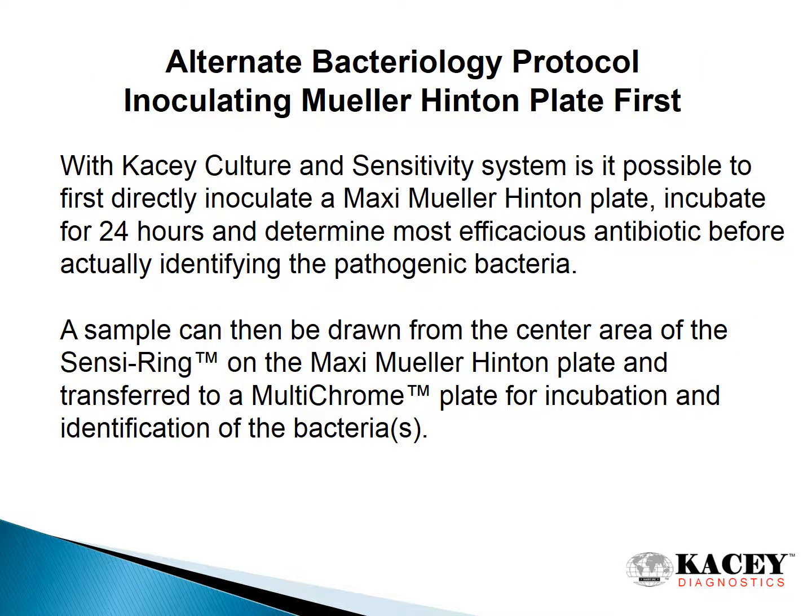Alternate bacteriology protocol inoculating Mueller-Hinton plate first. With Kacey culture and sensitivity system, it is possible to first directly inoculate a Maxi Mueller-Hinton plate, incubate for 24 hours, and determine the most efficacious antibiotic before actually identifying the bacteria. A sample can be drawn from the center area of the SensiRing on the Mueller-Hinton plate and transferred to a MultiChrome plate for incubation and identification of the bacteria.